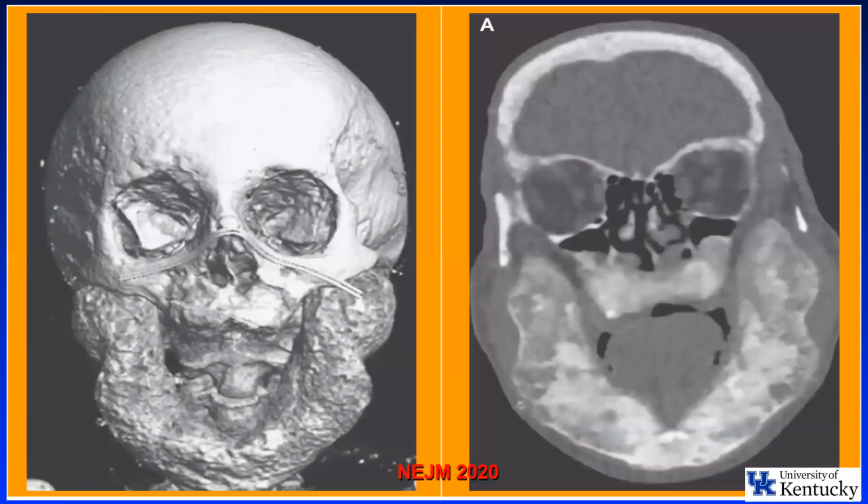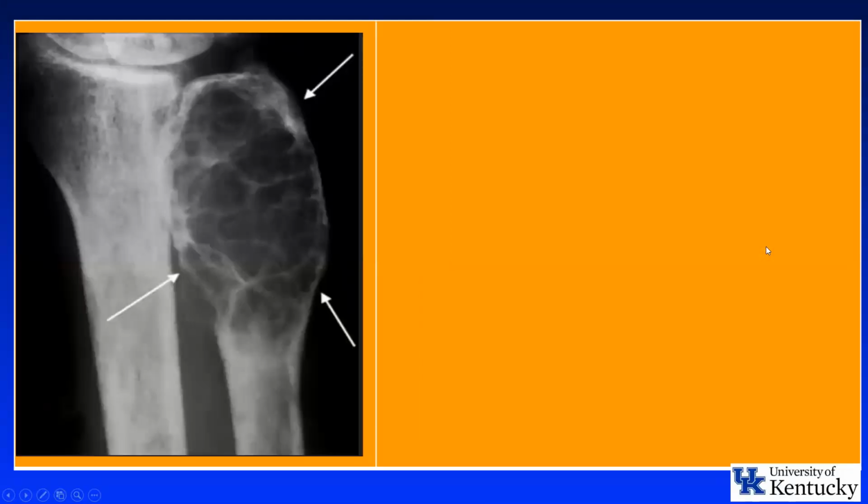This image was published last year in the New England Journal of Medicine. And I used to see this in Egypt before I moved to America many years ago. Not rare, I see these dysmorphic features with this mandibular enlargement. We call this brown tumor or osteoclastoma. And also it's big, but it's very soft, it's very lucent. And here is another image of osteoclastoma.